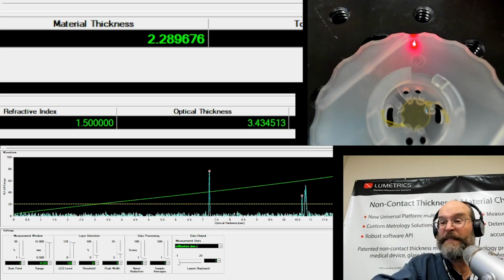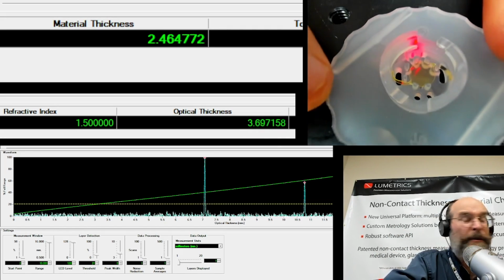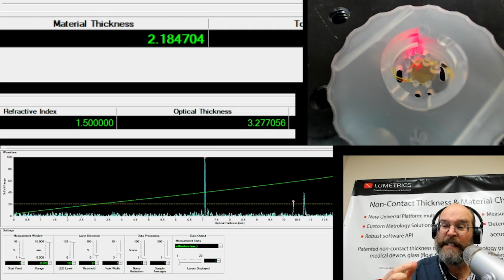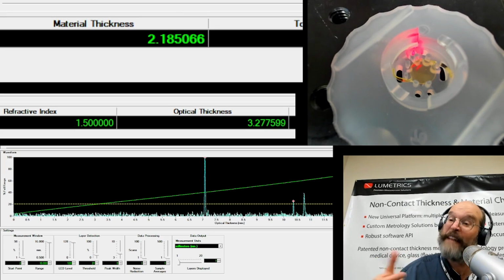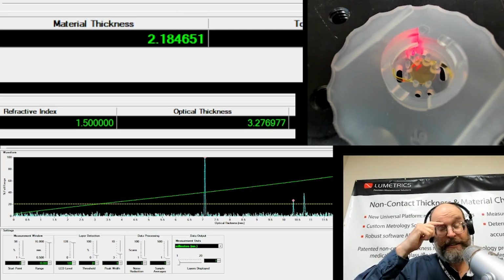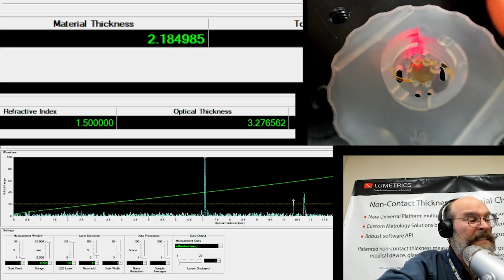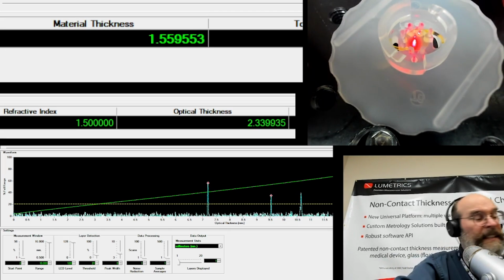The other thing you're going to measure is center thickness. That's another critical parameter of an intraocular lens. Intraocular lens's power changes with the curvatures, and steeper curvatures cause a stronger, a fatter center thickness. So higher power lenses are a little thicker than lower power lenses. The lens we have right now is a 6 diopter lens, so it's actually fairly thin.